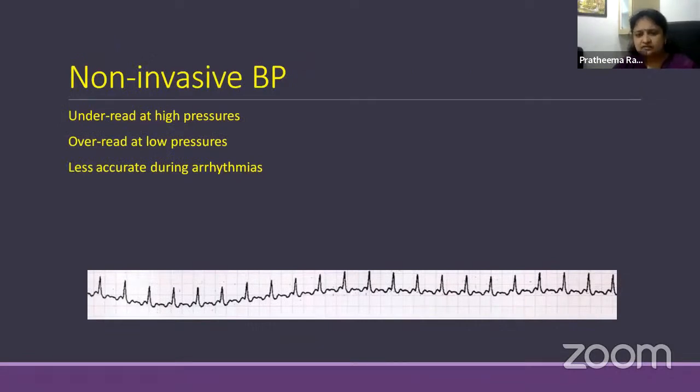So it is a way in which it measures the oscillatory parameter. The blood pressure has a pulse and the pulse over the brachial artery is just monitored by the sensor in the cuff. And the oscillatory method just calculates where the oscillation is higher, lower, it makes a calculation and gives us a reading. But if there is an arrhythmia, imagine the patient is in atrial fibrillation. The patient will not be having a regular heart rate. So there can be changes and there can be a faulty blood pressure.